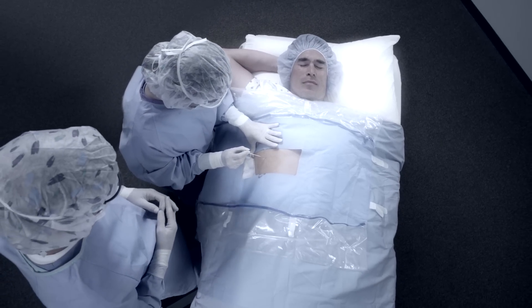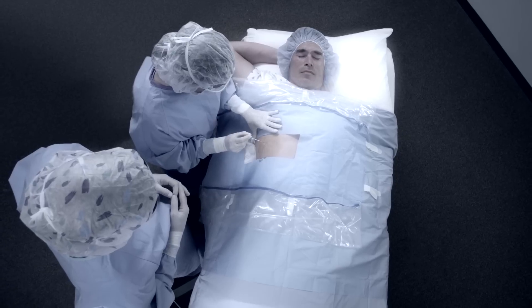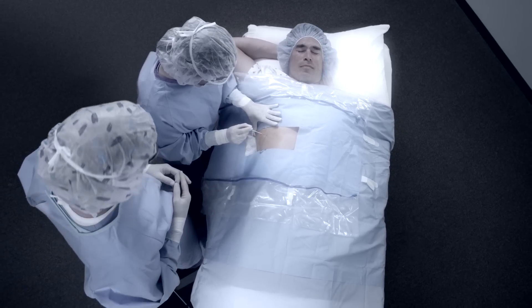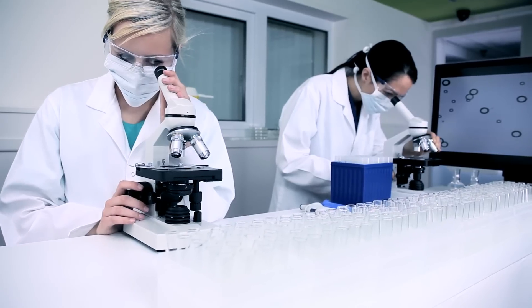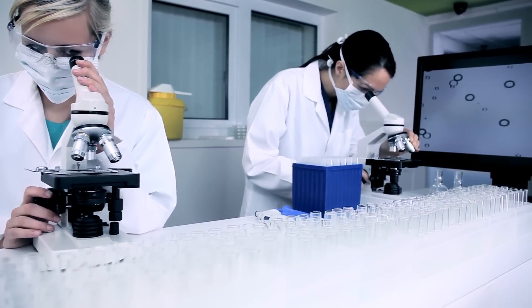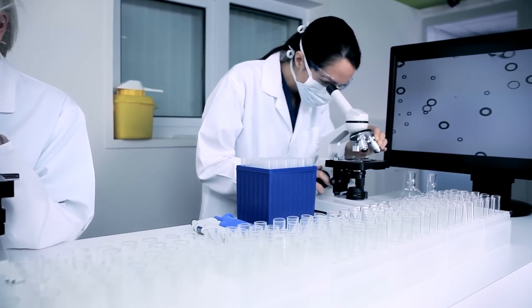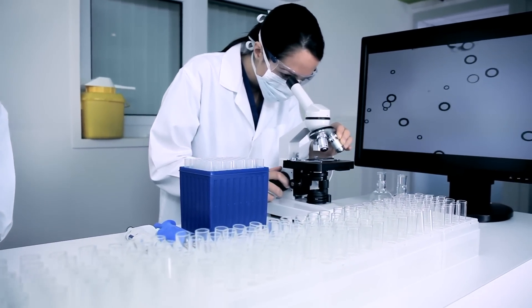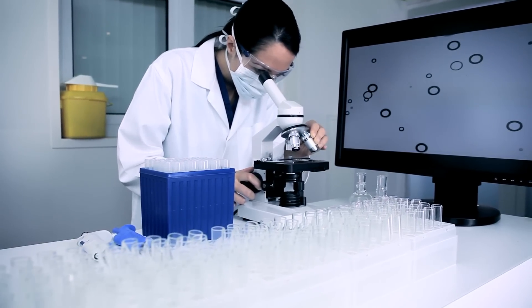They often need to be repeated to monitor the progression of the disease. In addition, liver biopsies, which rely on information from a small tissue sample, can also yield inaccurate results.